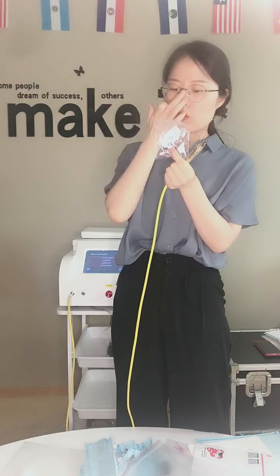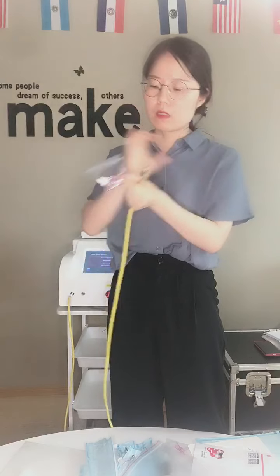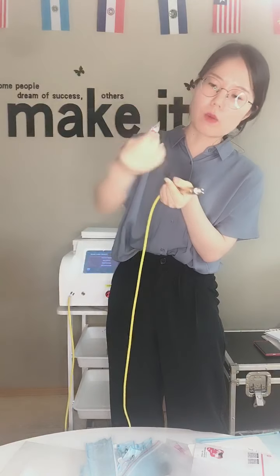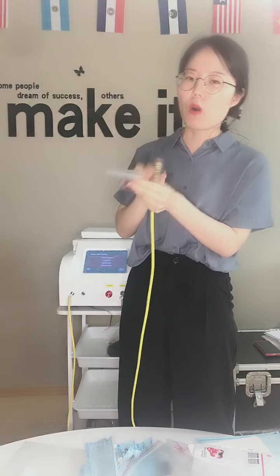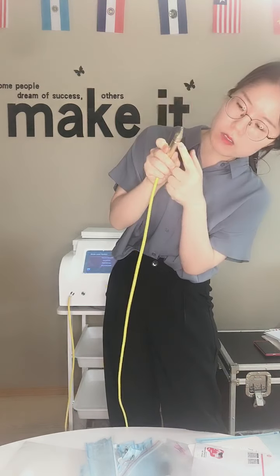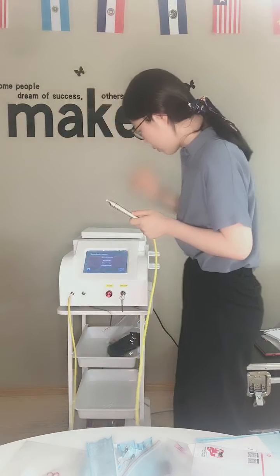What is the difference between the spot sizes? It depends on the veins on your body. If the veins on the body are very big, at this time you need to use the bigger one. And when the veins are very small or fine, you can use this smaller one on the handpiece. This is a standard spot size here. Okay, and can I show you how it works?